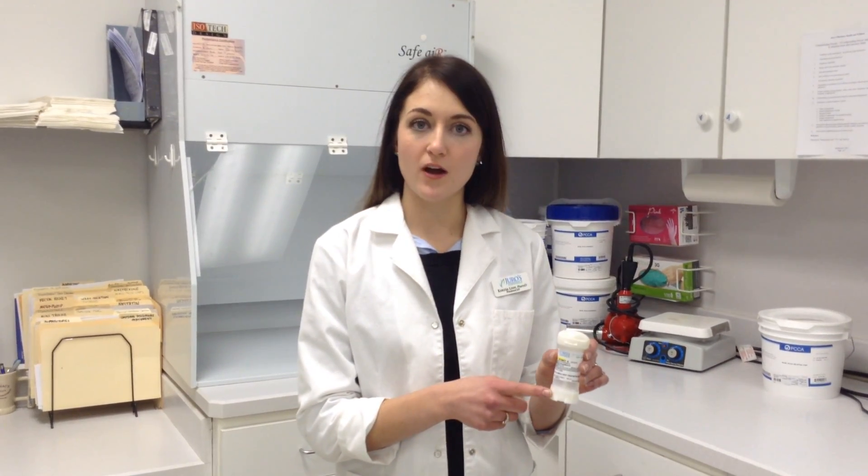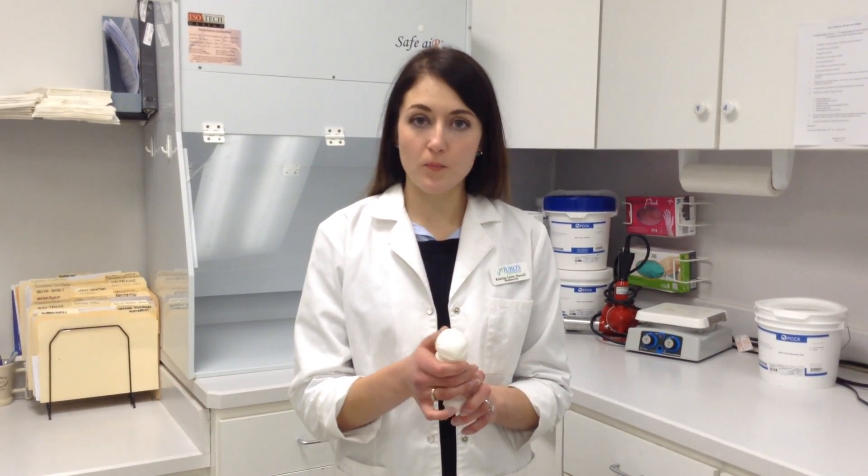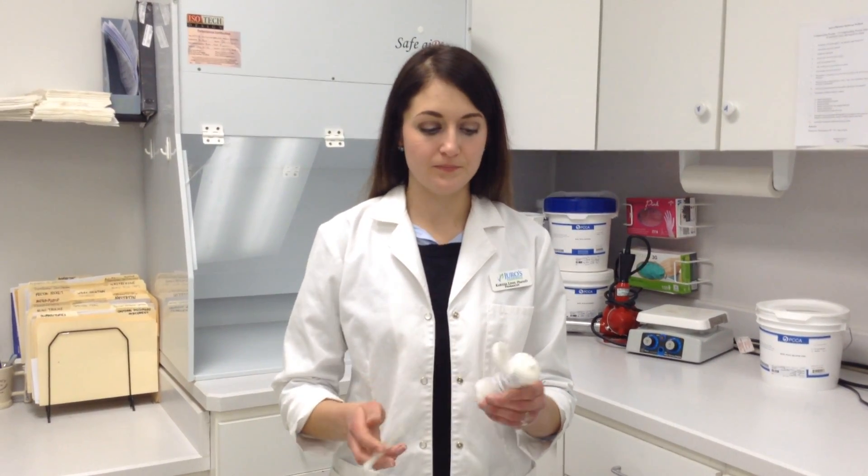Each click refers to a turn of the base of the unit and dispenses one quarter of a milliliter of cream. Gently open the top of the ToppyClick using your thumb and remove the applicator from the plastic if this is your first time using the device. Hold the ToppyClick vertically and snap the applicator into place. You can leave the plunger as is at the base of the applicator.